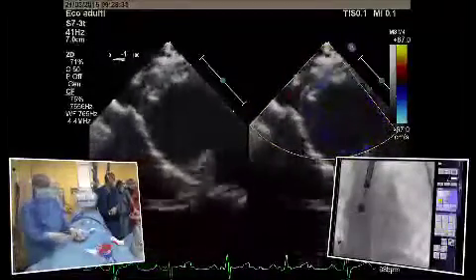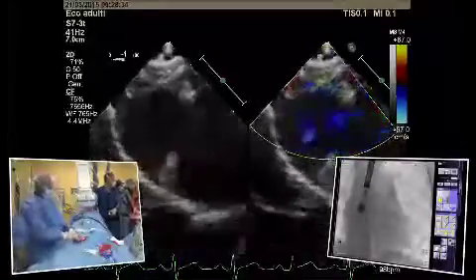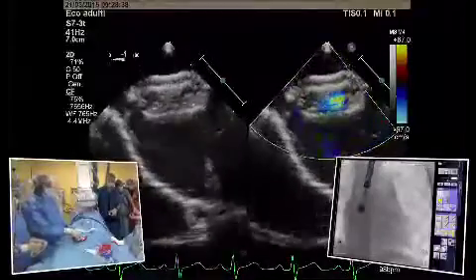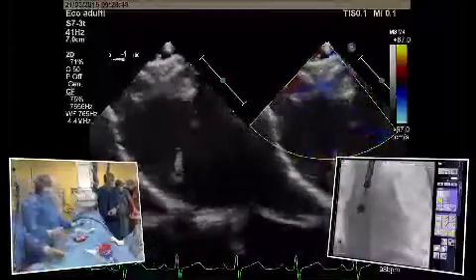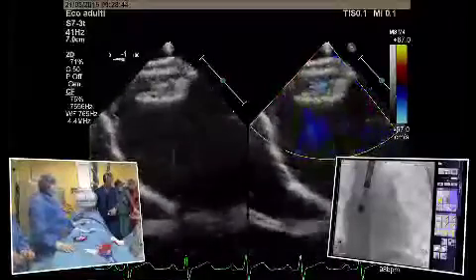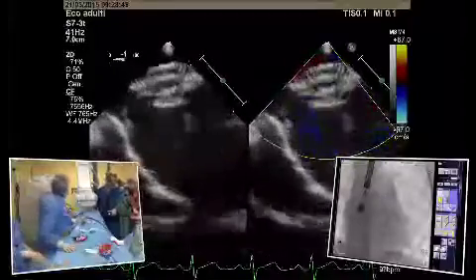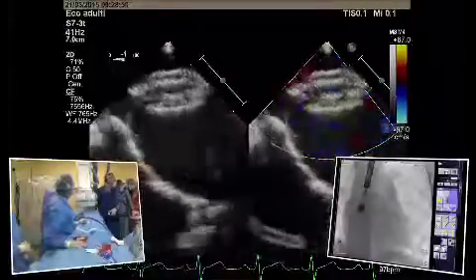Also here, very nice, the right atrial septum and the atrial septum on the other side. So 15 was the right decision. Okay, so we are happy, no rhythm disturbances, nothing. I think the position is okay according to the echo pictures.